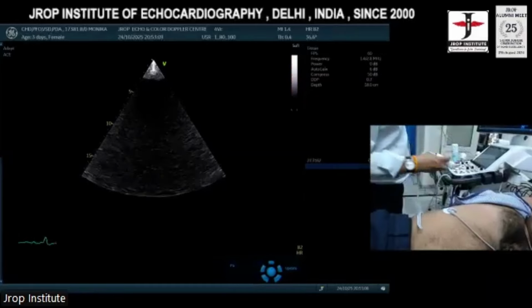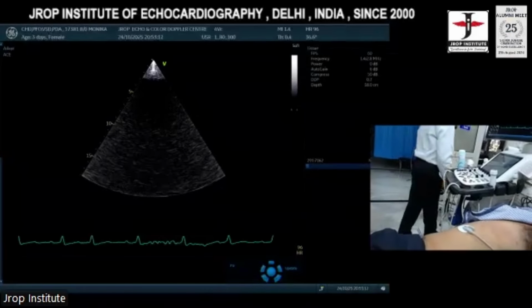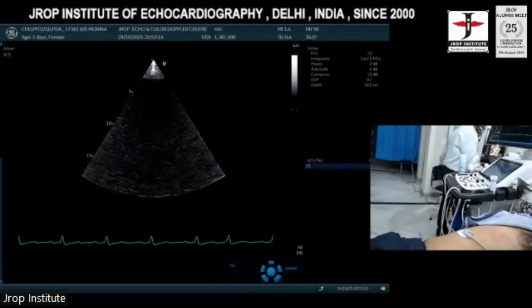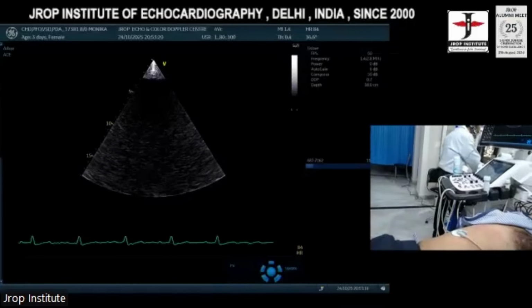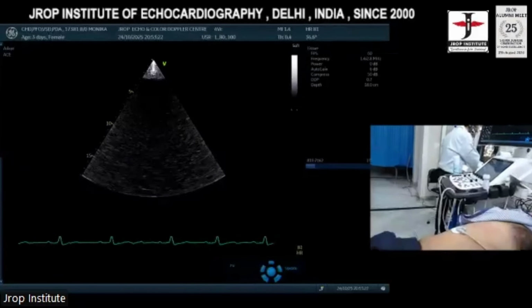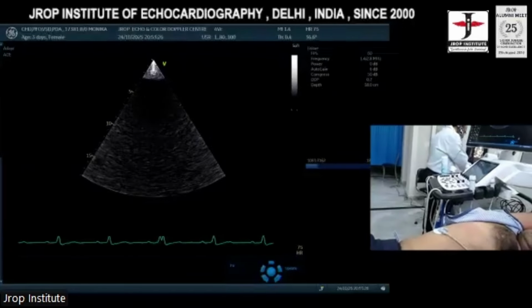Number 20, question. Shabir, your question. Sir, good evening, sir. Good evening. I have two questions, sir. One is, sir, in very obese patients and in female patients, I'm finding it difficult to get the optimal view. Can I do some adjustment so that I can get a good view, sir?